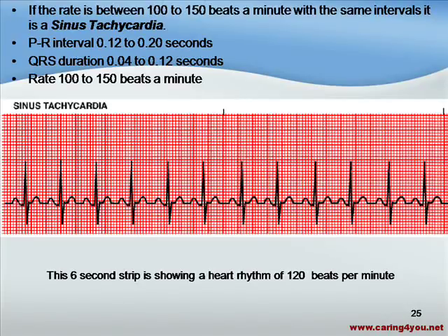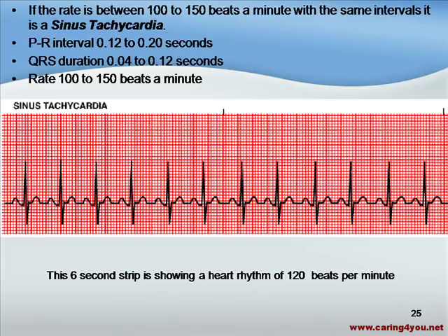Let's look at an EKG strip of sinus tachycardia. The PR interval fits the criteria. The QRS duration fits the criteria. The only difference is the rate. In this particular strip, we count the rate by counting the R waves: 1, 2, 3, 4, 5, 6, 7, 8, 9, 10, 11, 12. We take 12, multiply that by 10, and in this particular EKG strip we have a heartbeat of 120 beats per minute.